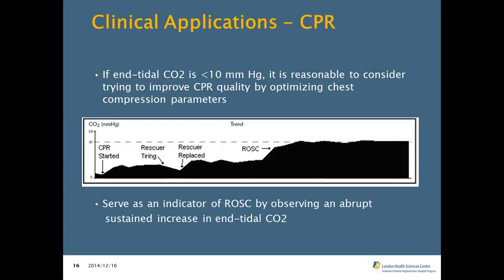Right. And I guess the same would hold true that if we had an intubated patient and we had a sudden drop in EndTidal CO2, that we could consider loss of spontaneous circulation or loss of pulse. Absolutely. So if you see that sudden decline, again, it's a piece of the puzzle. The other things you think, well, if it's a flat tracing, is the tube misplaced? So you're going to be taking this as a piece of the puzzle as to what's going on in the situation.